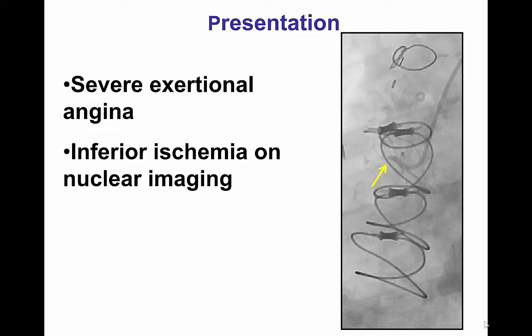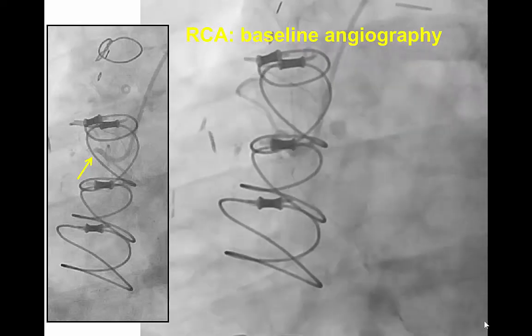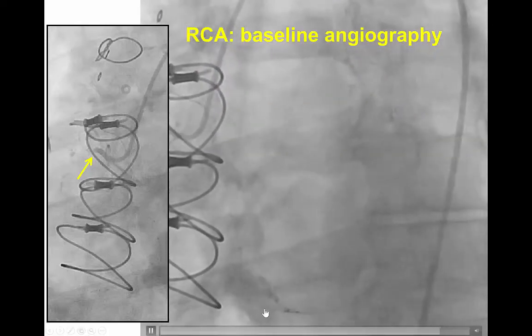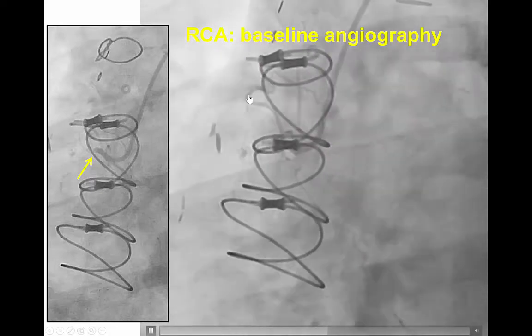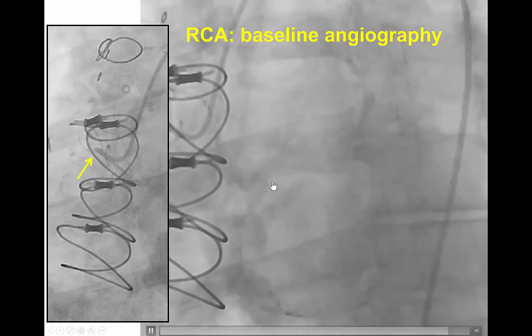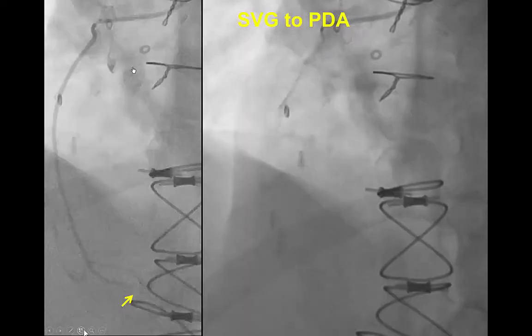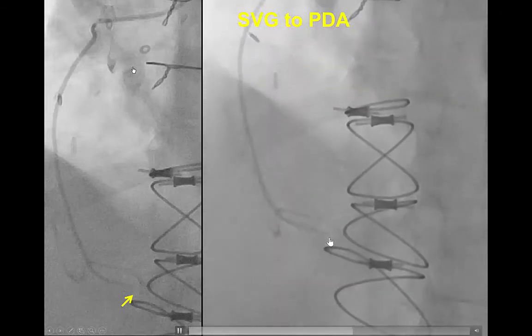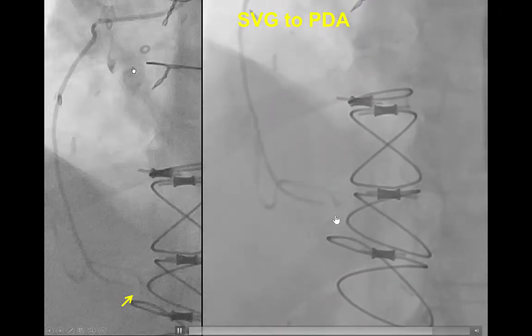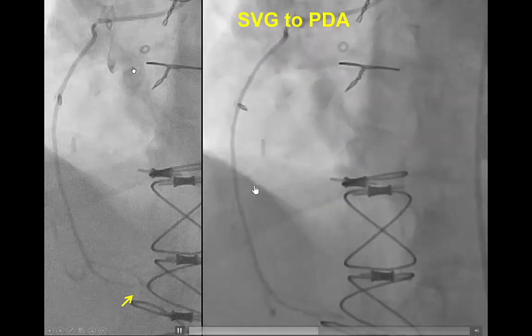The patient presented with exertional angina and had inferior ischemia on nuclear stress tests. Baseline angiography demonstrated a CTO of the proximal right coronary artery. There was a blunt stop with multiple small branches originating proximal to the proximal cap. The distal vessel was filling via a diffusely diseased vein graft with a severe distal anastomotic lesion. There was retrograde filling all the way to the mid right coronary artery.